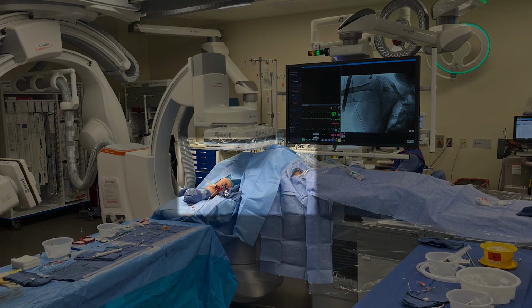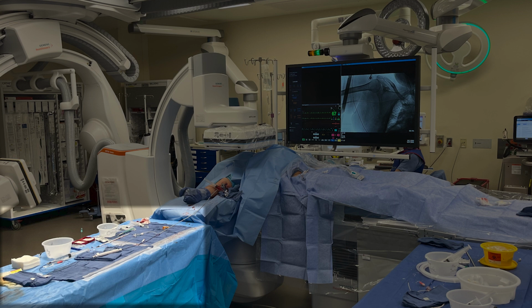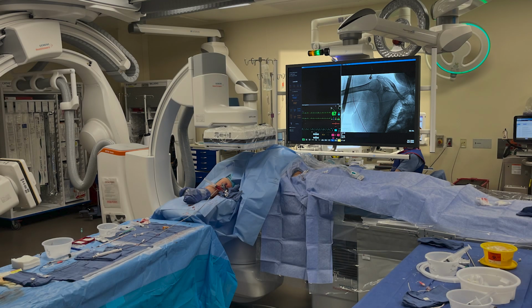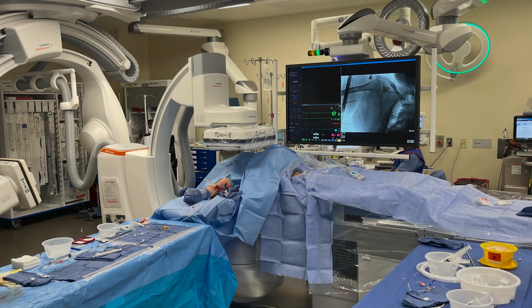This first area here that you can see in the middle is the patient prepped supine on the bed with their right arm extended out at 90 degrees. You can see an accessory table here on the patient's right side that allows for easy access to the devices that are in the right arm. I'm 5'7". I like to have my main working monitor directly in front of me at eye level across. And in the negative space here, you can see where our accessory monitor would exist. That way we don't have to turn to see the monitors as we are working, either when facing the patient or facing the patient's right arm.